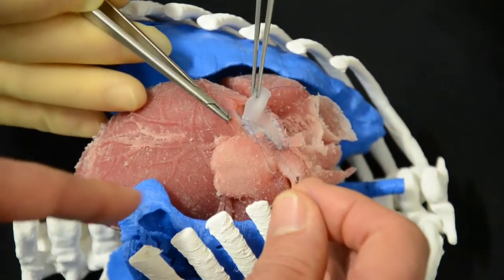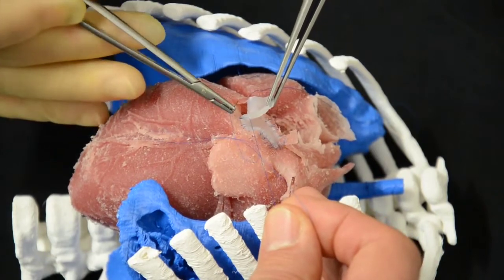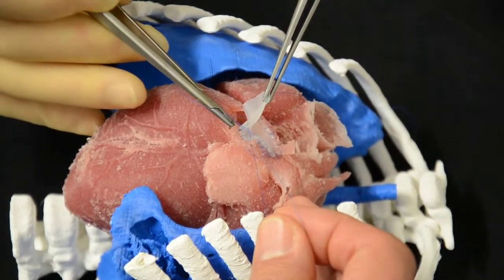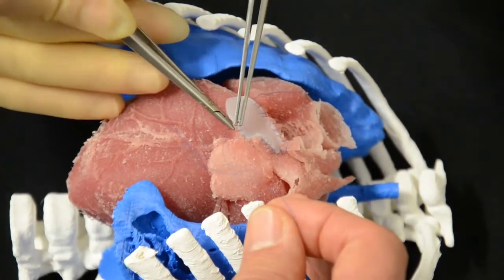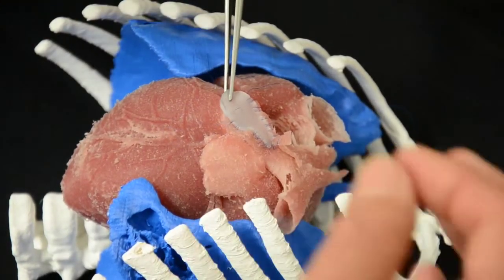You can demonstrate — see, just be rough and try to make a hole there. You can very easily make a hole. So you need to be as delicate as when you do the proper, real operation, which is absolutely crucial for the training part.